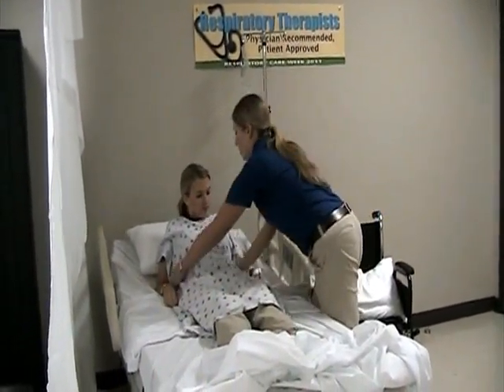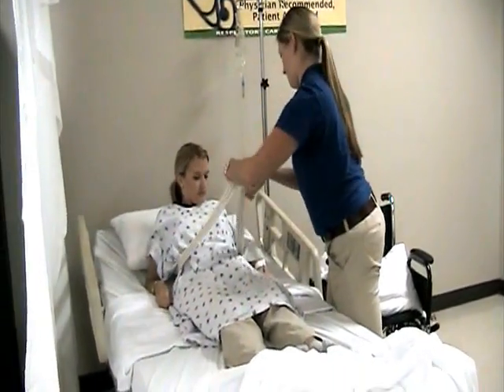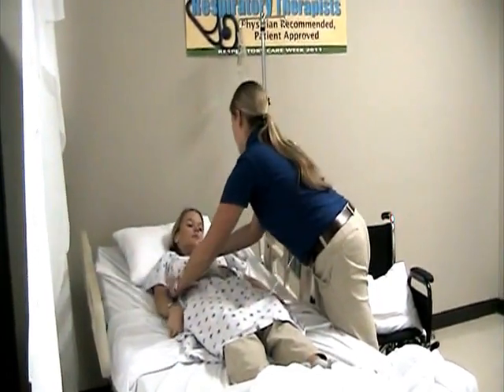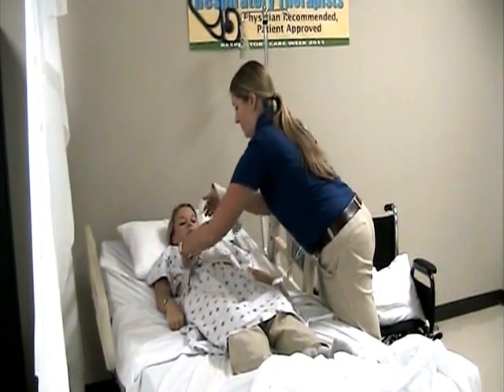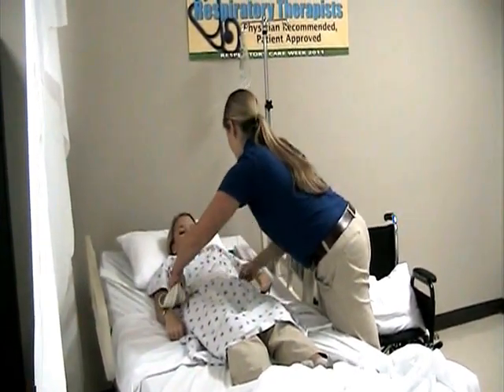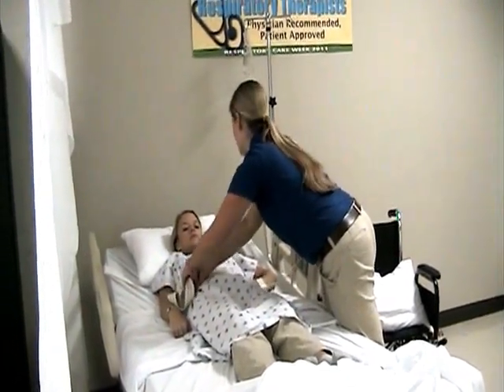All right, stay right there. I'm going to come around you and put the gait belt on. Okay, go ahead and relax. I want this nice and snug.